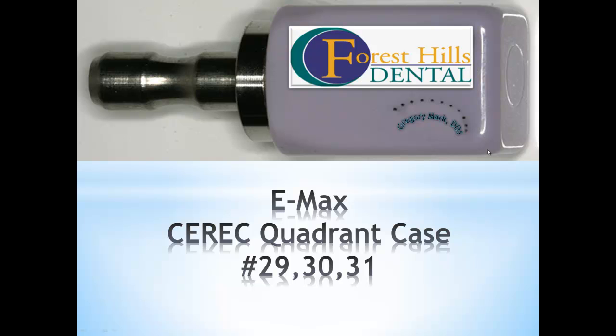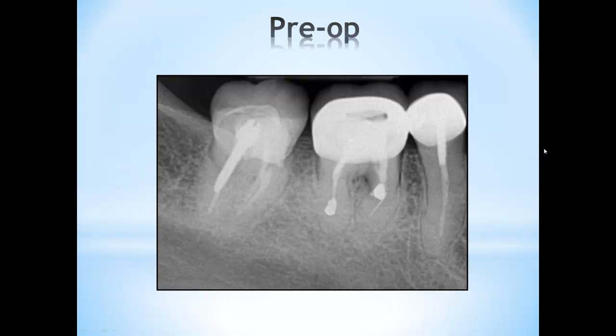So let's start from the x-rays. Crown number 31 was done a couple of years ago. That's by Emax. We're taking post-op pictures and seeing how the margin fits. And by taking these x-rays, it looks perfect. The patient was dismissed.